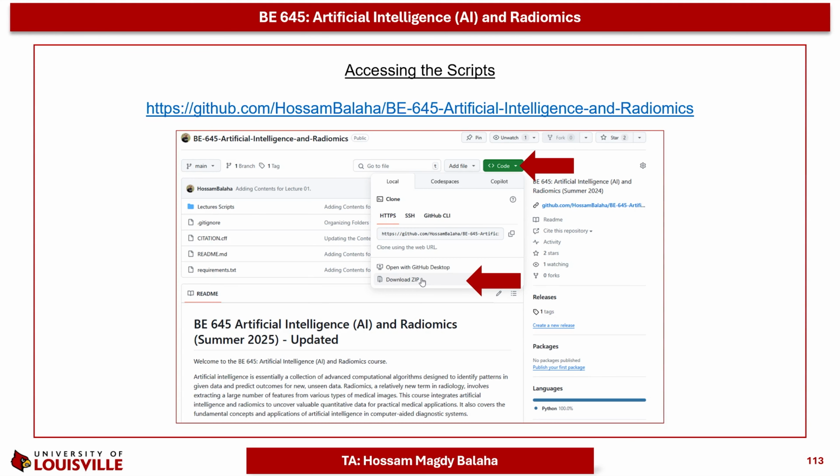So in this lecture, we presented a simple project on how to extract first order features and GLCM features from a public dataset. So instead of just applying it on a single image, we are now able to apply it on a whole dataset with different categories inside it. We emphasize the importance of the interpretation after extracting the features, whether you are comparing between the different categories or inside the same category, because at the end we will present the machine learning model. So we need to ensure that the model is working correctly as intended, or as we interpreted the different features.